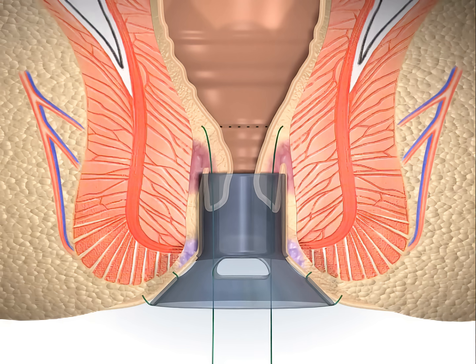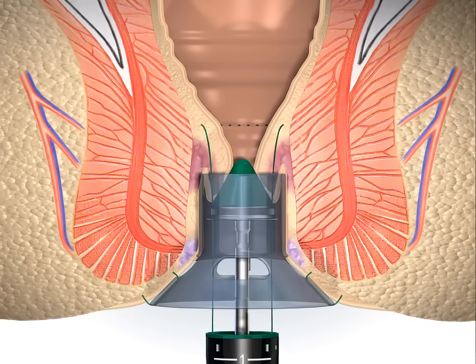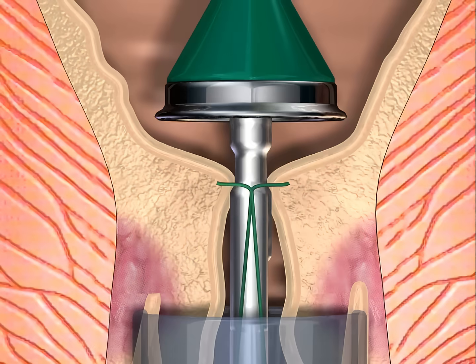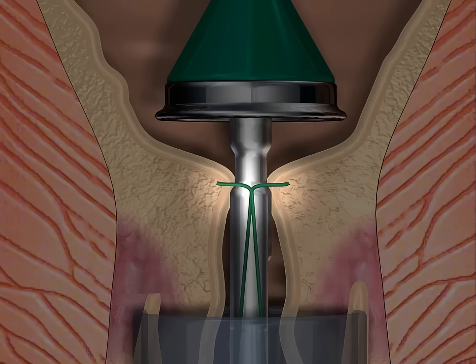Once the purse-string suture has been completed, the hemorrhoidal circular stapler is fully opened and inserted with the anvil placed beyond the purse-string suture. It must be confirmed that the anvil crosses the purse-string. A careful examination is conducted to confirm that the entire circumference of the mucosa is up against the center of the rod.